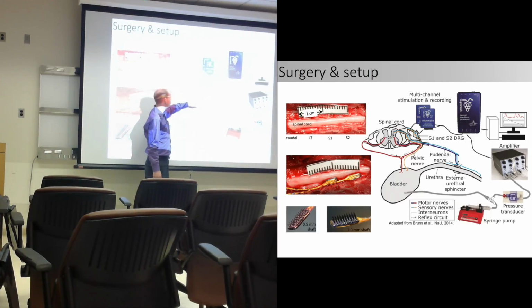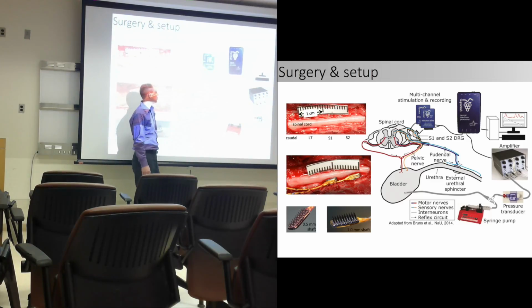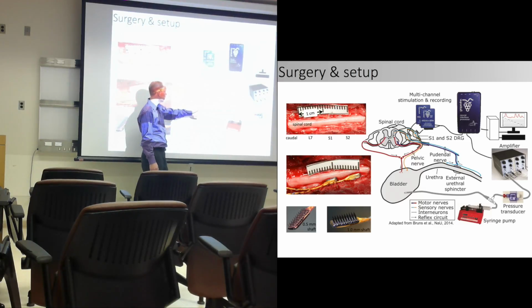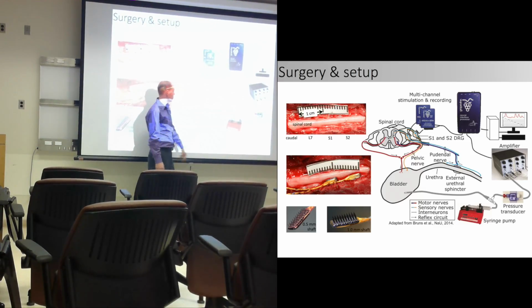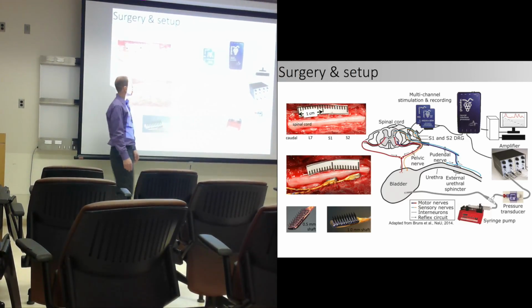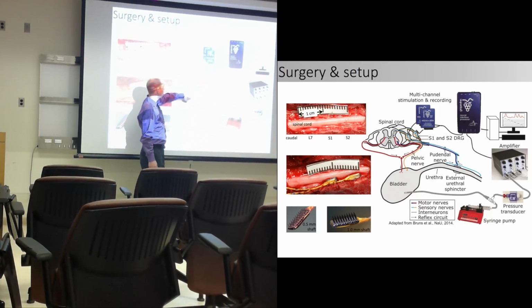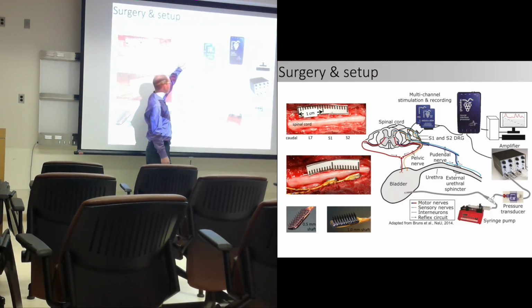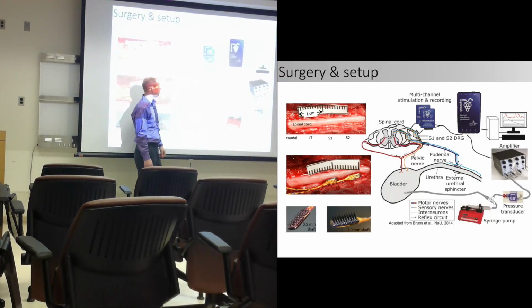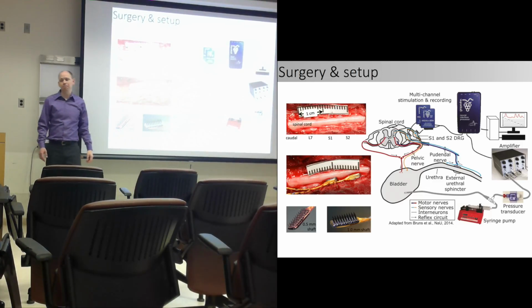In cats, S1 and S2 is similar to S2 and S3 in humans. And it allows us access to both the pelvic nerve afferent fibers from the bladder, as well as the pudendal nerve afferent fibers coming down from the urethral sphincter, and other structures in the perineal region. We put a bladder catheter in, which gives us the ability to both control the volume and monitor the pressure. So the goal might be to stimulate the pudendal pathways, which can then drive pelvic nerve functions, or connect to other spinal levels, like the hypogastric nerve, and come down into bladder relaxation, or record some of the afferent pathways to understand what's going on in the system.